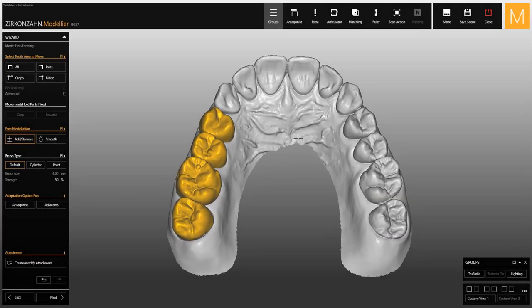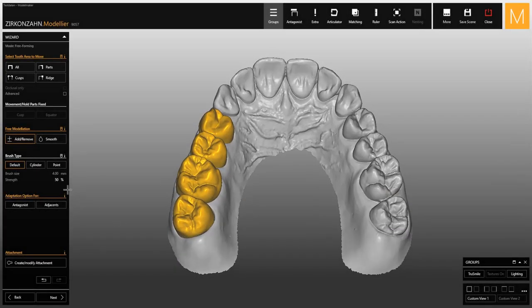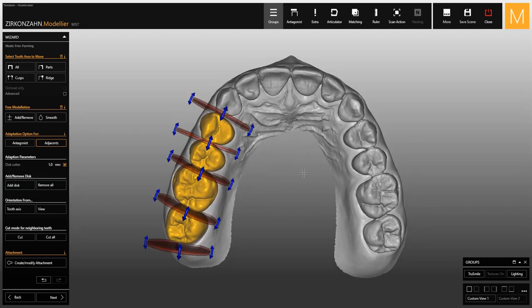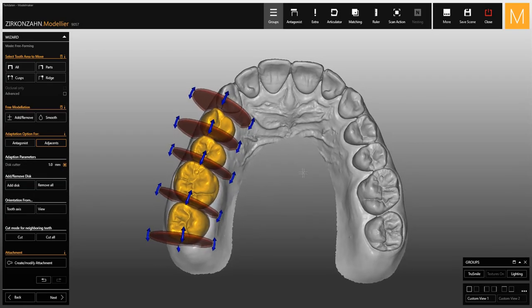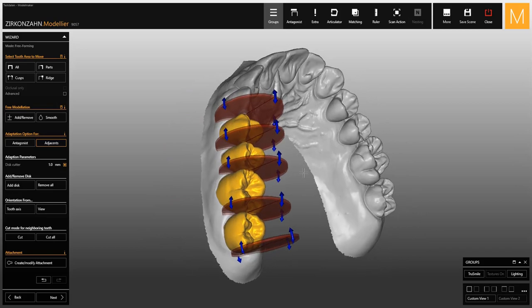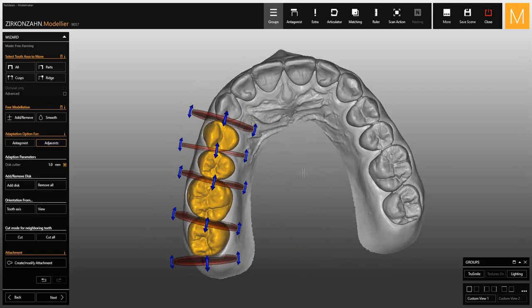During the free design, it is possible to separate adjacent teeth with a tool called the disk cutter. When this option is selected, the disks automatically appear between the teeth.